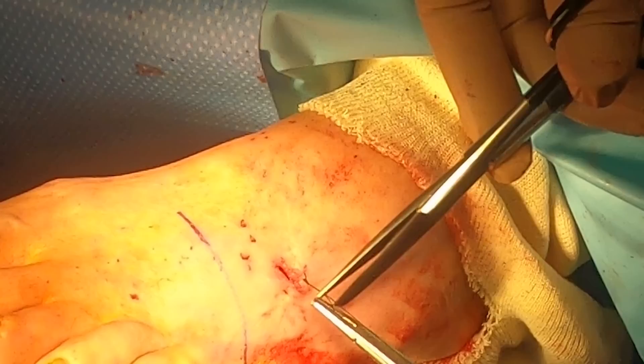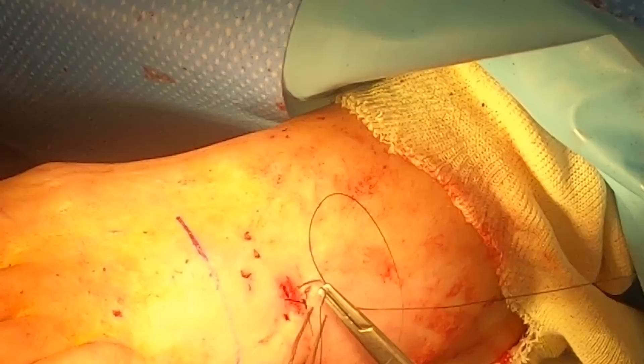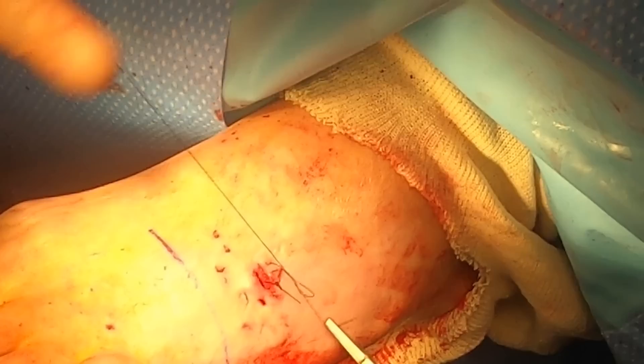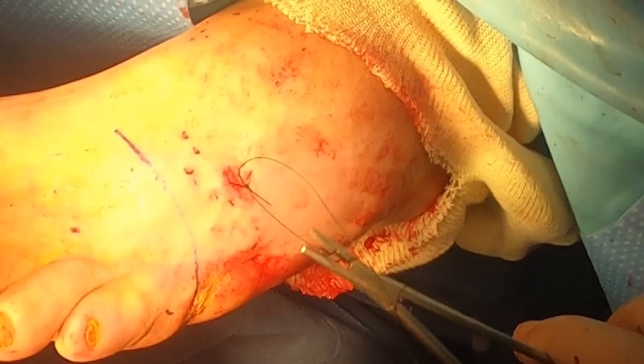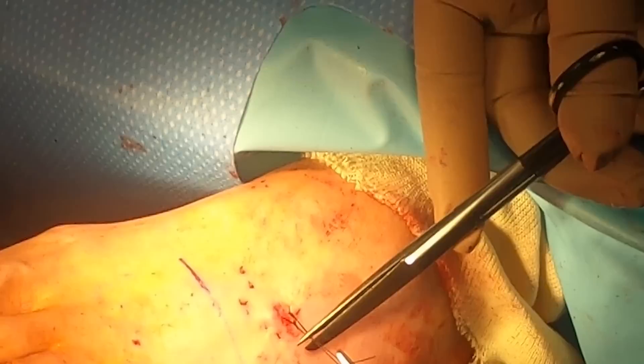Once we have this top incision closed, we'll move to the bottom. I took out all that metatarsal bone, so now we've got this kind of deficit in the soft tissue. I don't want a hematoma to form or further space for infection to still linger. So what we decided to do on the bottom is essentially pack it.